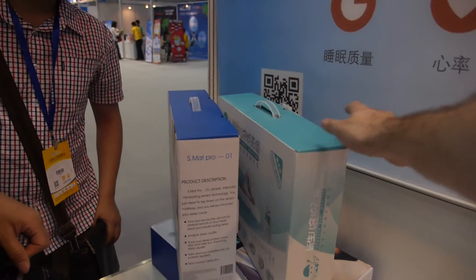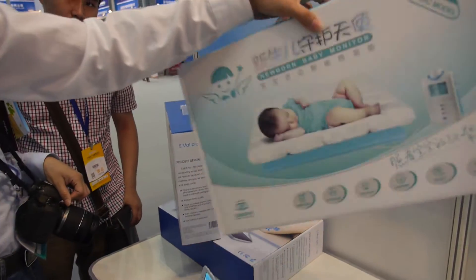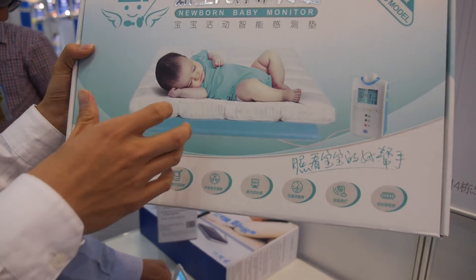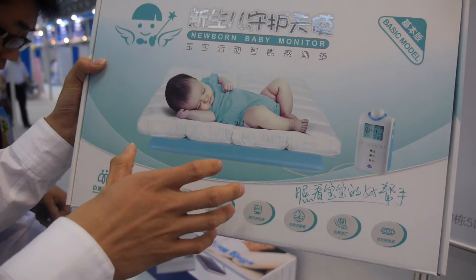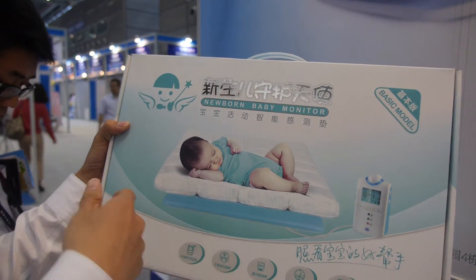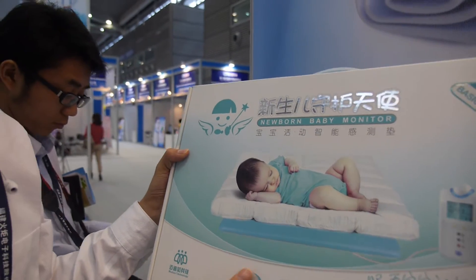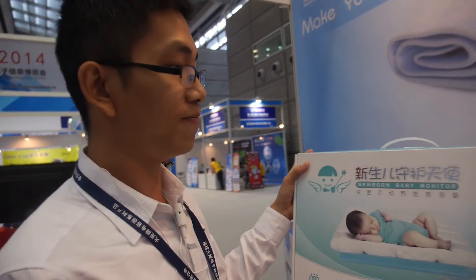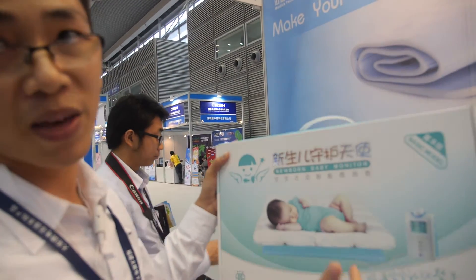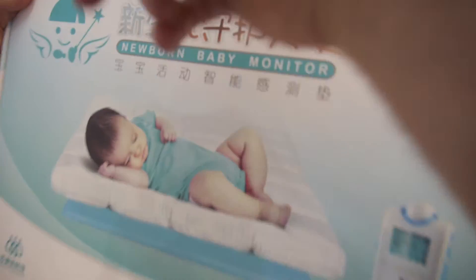This version is for the baby. It can monitor the baby's movement and breathing. If the baby stops breathing or stops moving for 20 seconds, it will alert with a sound. However, it cannot be connected to your mobile phone — that may be a feature in the future version. This is our first version.